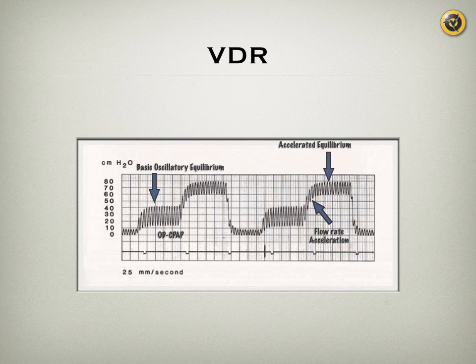Oscillation ventilation. Usually the frequency of oscillation is between 400 and 600. At the same time, there are increased and decreased flows. No pressure, but increased and decreased flow. So you're oscillating flows. Say you're starting at a flow of 10 liters per minute, and then you're increasing that to 40 liters per minute, and then to 60 liters per minute for a period of time.